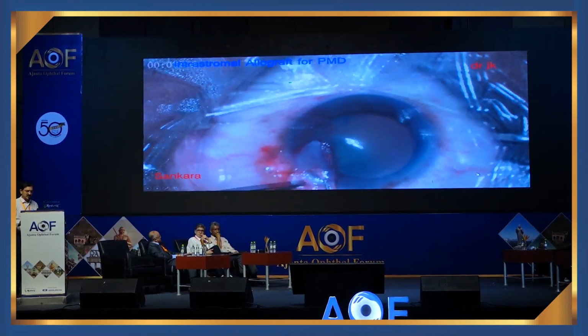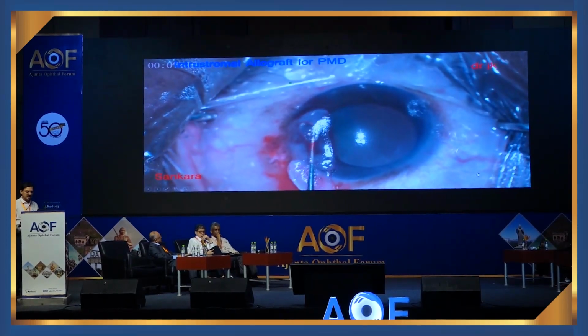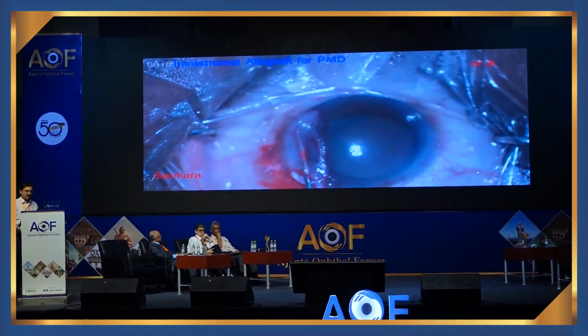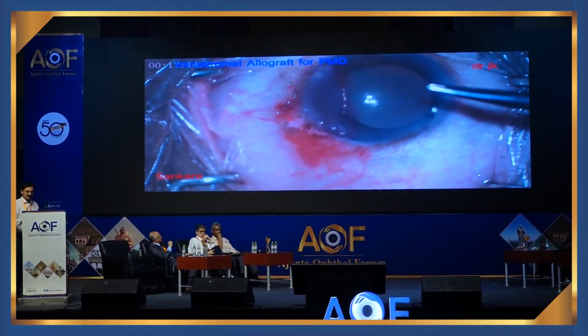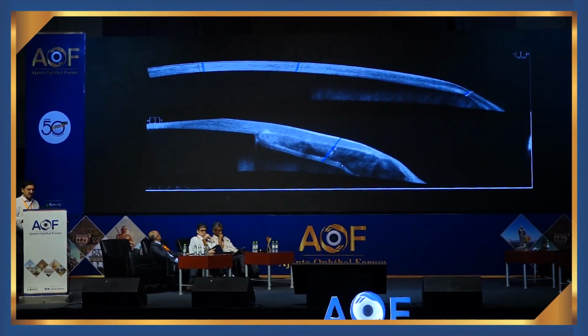And you insert the graft slowly. It's nothing great in that. You insert and iron it out in the inferior portion, which is not the visual axis, so we are very safe here. And sometimes you put a suture, sometimes you don't. So from 200 we can bring it out to much better in the inferior.